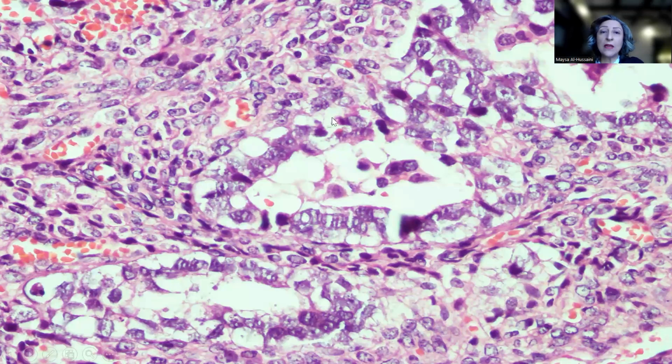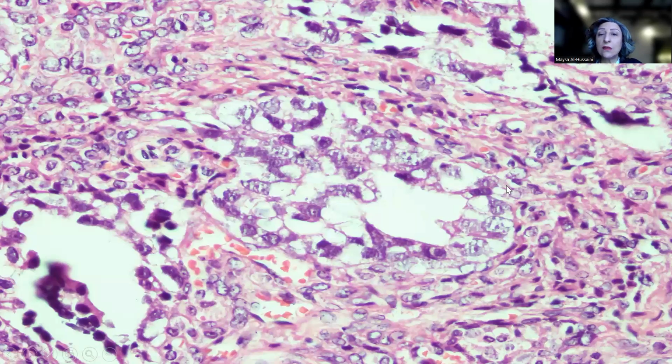And on high power magnification, these are the glands, variably sized, and the lining cells show abundant clear cytoplasm, vesicular nuclei, and prominent nucleoli. This is another field where we have the glandular formation, and those cells lining the glands really composed of abundant clear cytoplasm, vesicular nuclei, prominent nucleoli, more than one nucleus at some instances.